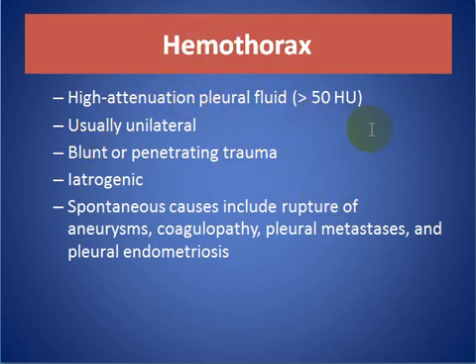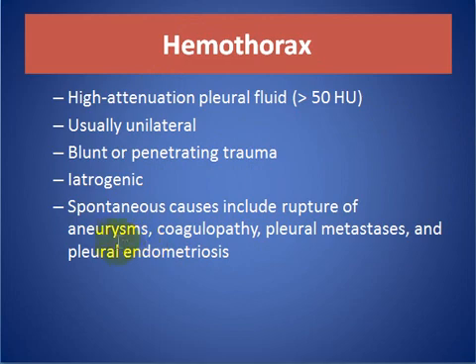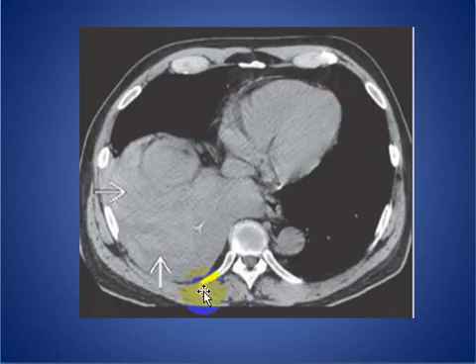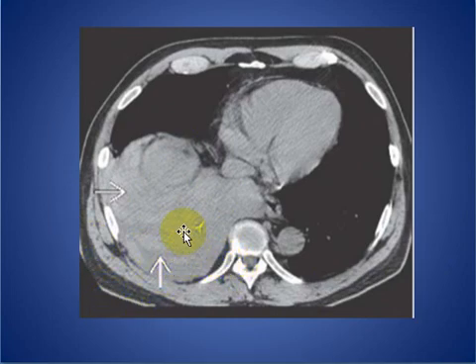Hemothorax shows high attenuation pleural fluid, more than 50 HU, usually unilateral, with a history of trauma or iatrogenic cause. Spontaneous causes include ruptured aneurysm, coagulopathy, pleural metastasis, and pleural endometriosis. Here we see a non-contrast CT scan with heterogeneous and high attenuation pleural collection and pleural thickening in this patient.